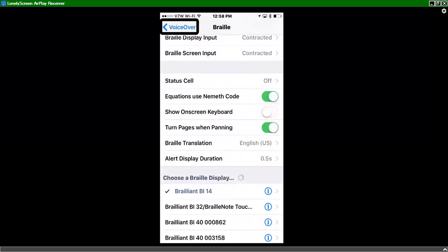And you see that I'm right back in the settings menu just by using that joystick. So virtually all of your navigation or at least navigating among the swipe gestures or using the swipe gestures that you'd be using on your iPhone, whether it's the one finger swipe left, right, up, or down, can all be done just by flicking the joystick left, right, up, or down. And to perform a double tap, you just press in on that joystick.